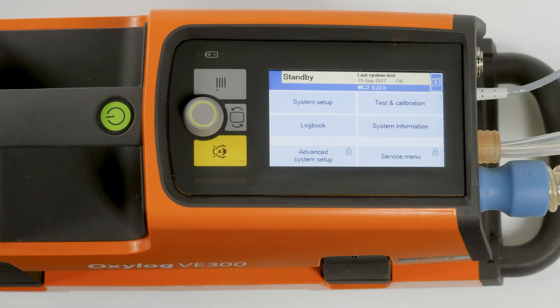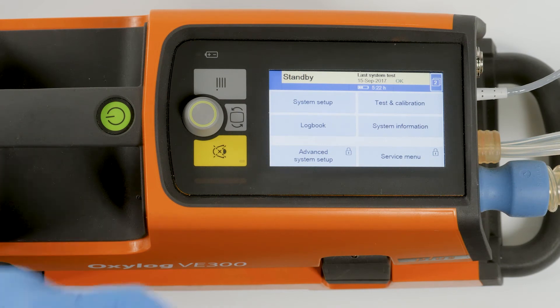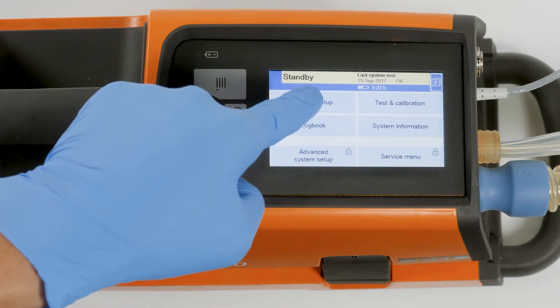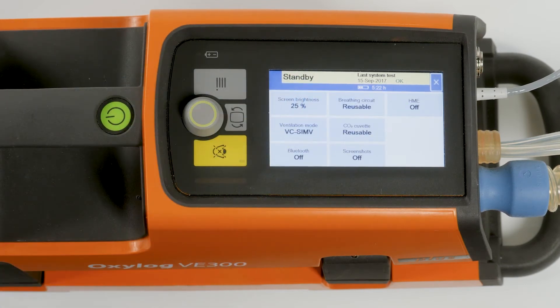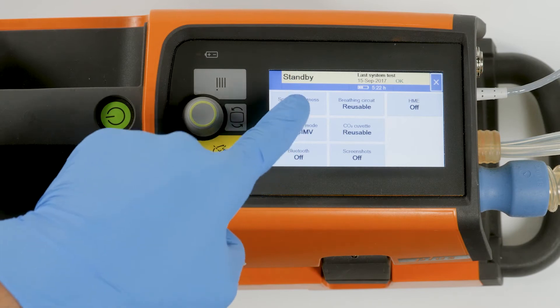To access the configuration dialog, touch the button System Setup. In the configuration dialog, the following information can be displayed and changed.